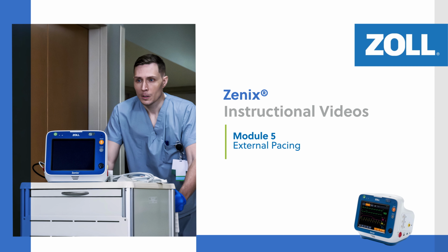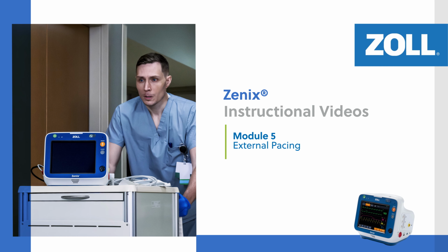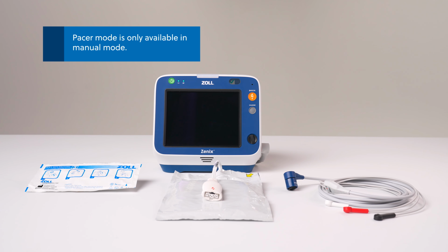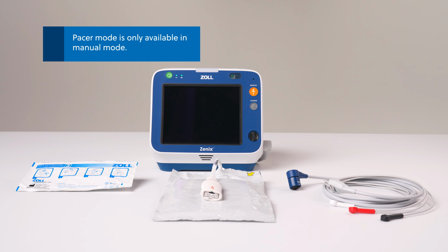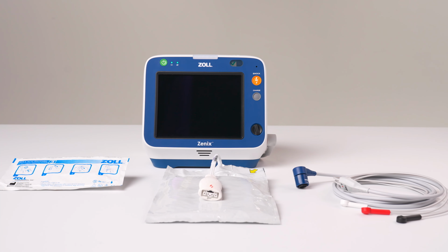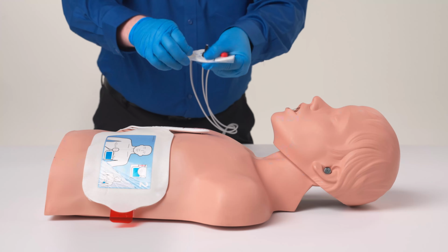In this video, we review the external pacing features of the Zenix Defibrillator monitor. Zenix can provide demand or fixed pacing. This module focuses on demand pacing using Zenix CPR electrodes.